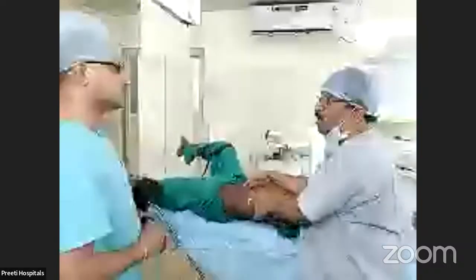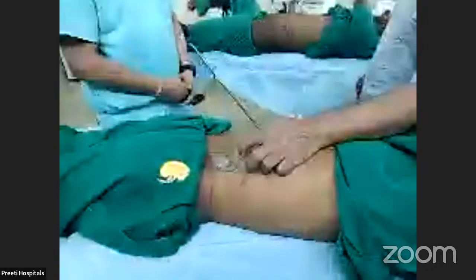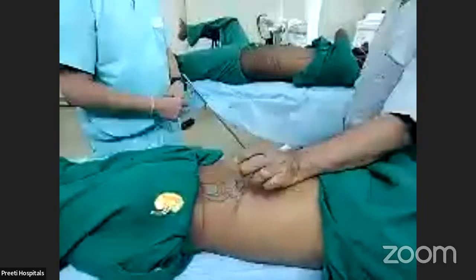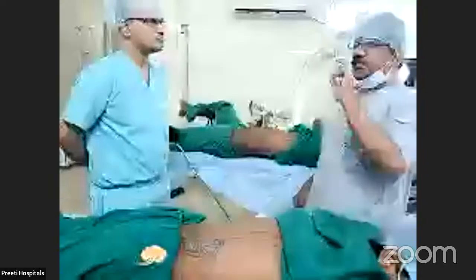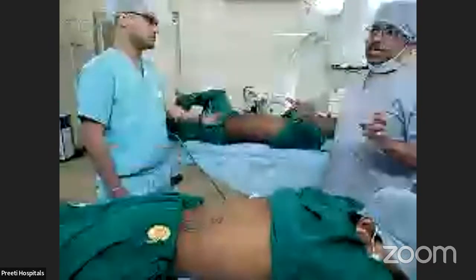But if you cannot look, then you have to puncture. So here you puncture the inferior calyx, and you look down. Why? This inferior calyx is more anterior here. If you puncture here, for the rest of the things you have to look up only, but it is manageable, because this iliac crest will not come into the picture. Do you agree on this? So an inferior calycial stone is always a disadvantage to supine PCNL. Inferior calycial plus pelvic stone is also a disadvantage to supine PCNL.